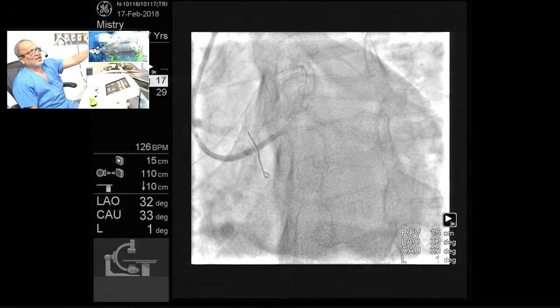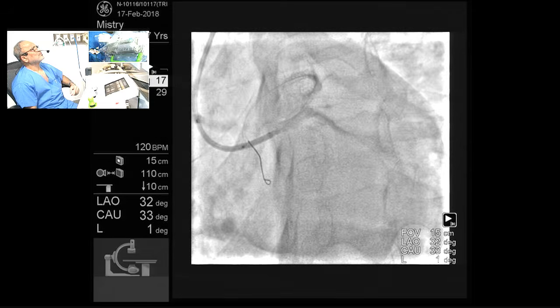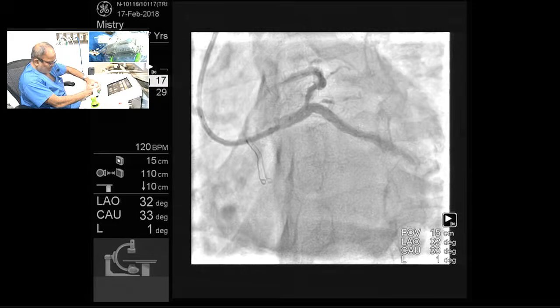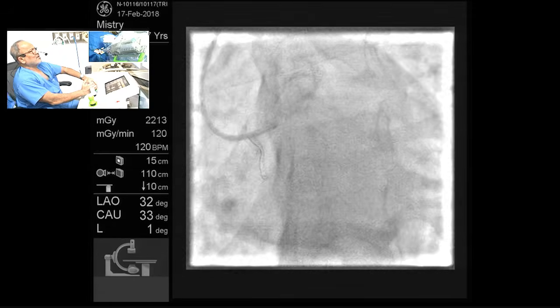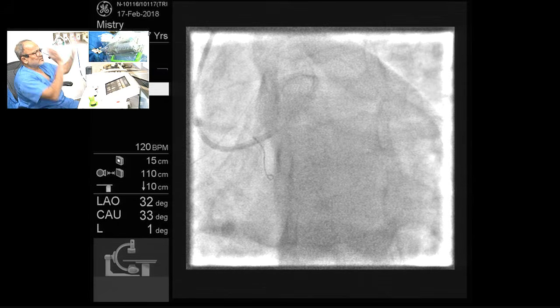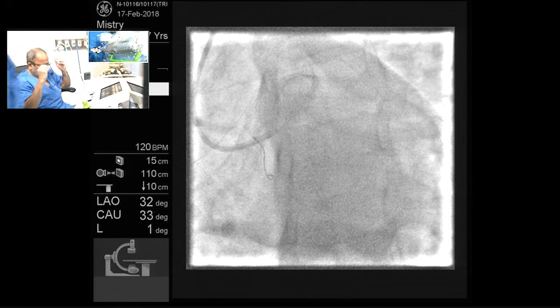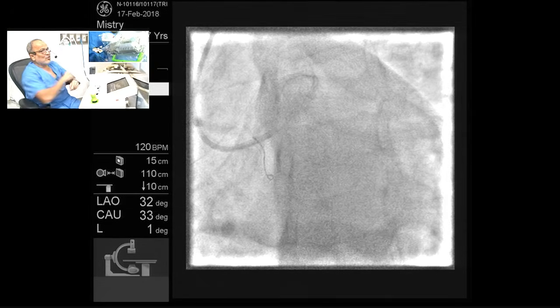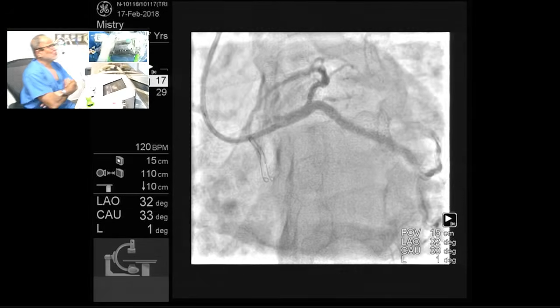You saw there is an angle. And this looks good. So now I am pushing this turbo button to remove my stent very quickly out. Okay. Stent 3 by 28, or 3 will be very big for the ostium, Sanjay. What do you think?